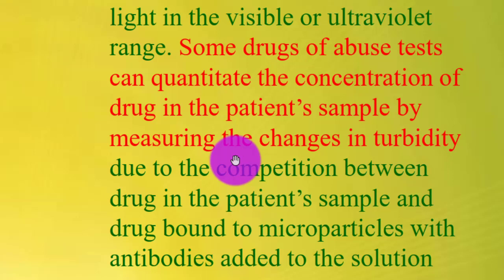Some drugs of abuse tests can quantitate the concentration of drug in a patient sample by measuring the changes in turbidity.